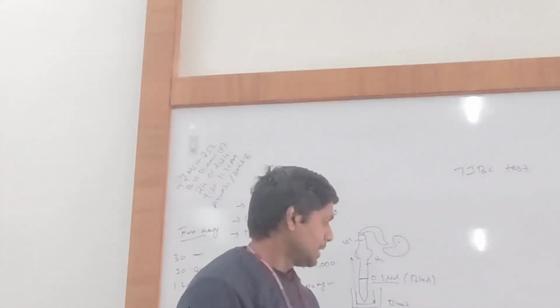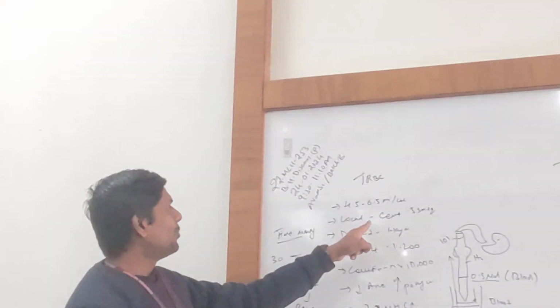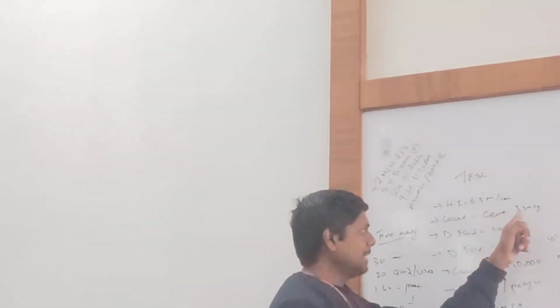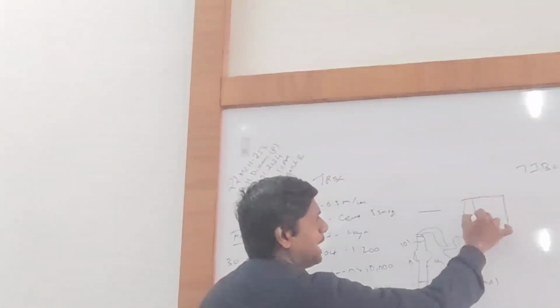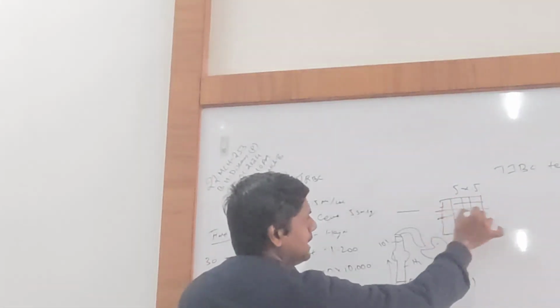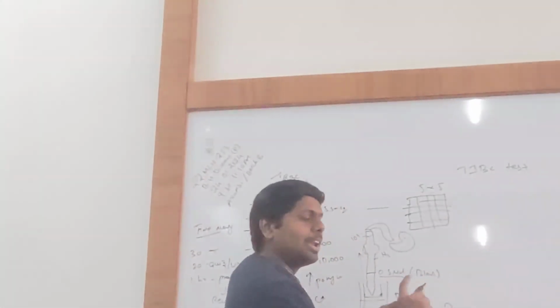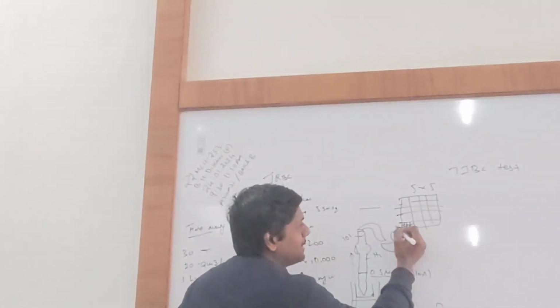This one. So always we are saying this one. You already know the point. What we say, we are counting the cells in the central square. In central square, overall has been divided into 5 into 5 grid. That we know. Am I correct? It is a 5 into 5 grid. When we say each small square is 4 into 4 grid.